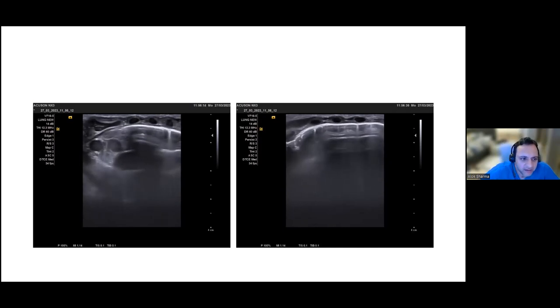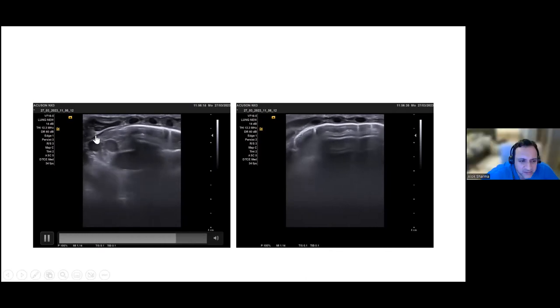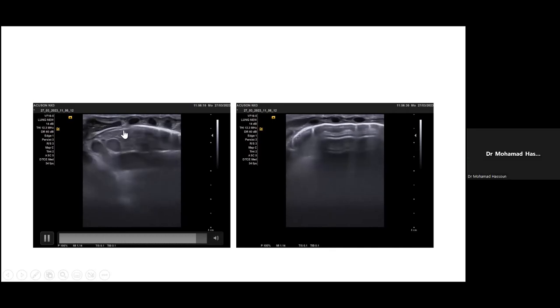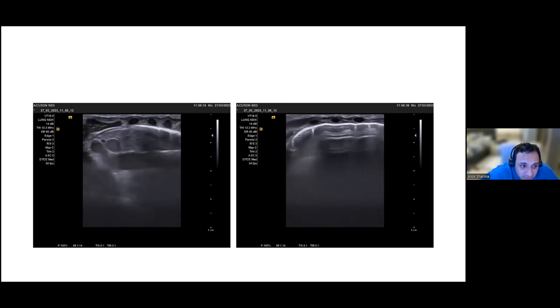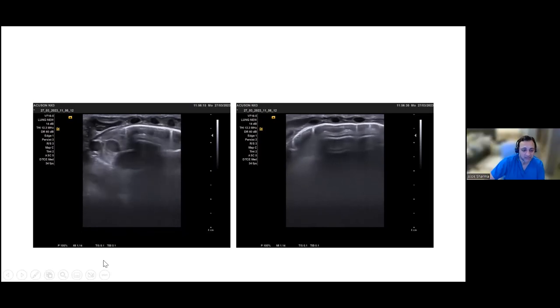My only comment in R1 is whether you have just a little bit of an effusion there. Or just here? No. Just at the top here, where the thymus is. It's difficult. My gut feeling is that's not, because I think the pleura ends. So can you see the rib? So that is pleura. And I just have a feeling that's thymus with the capsule. So that's not enough. Okay. Yeah. So that's thymus in the top left hand with the two big cysts that you see. And then you can see in R1 a very nice pleura.